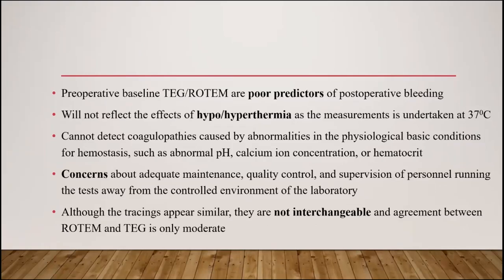And last but not the least, these tracings are not interchangeable. So if a patient was initially monitored using TEG, it is required that subsequently he or she be monitored on TEG and not be switched over between TEG and ROTEM as per convenience.